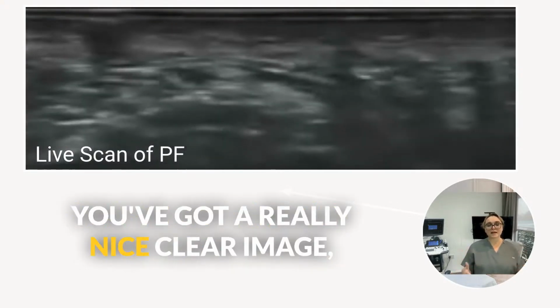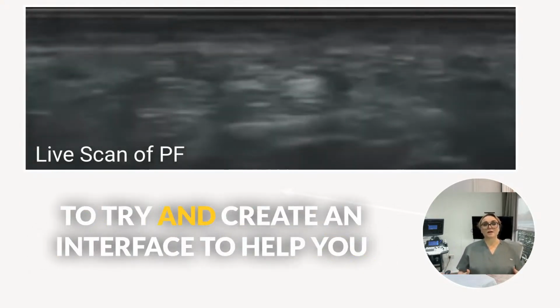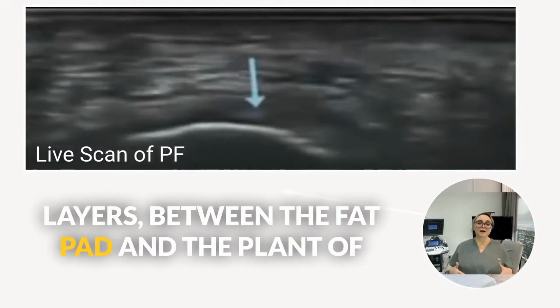Once you've got a really nice clear image, you can palpate the subcutaneous fat layer to try and create an interface to help you see the difference between the tissue layers, between the fat pad and the plantar fascia.